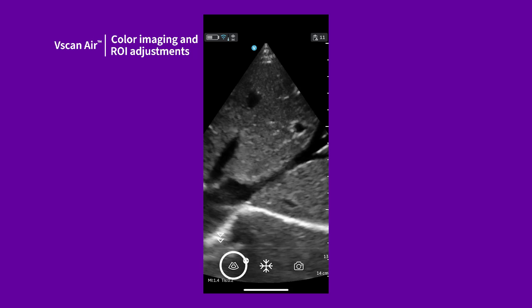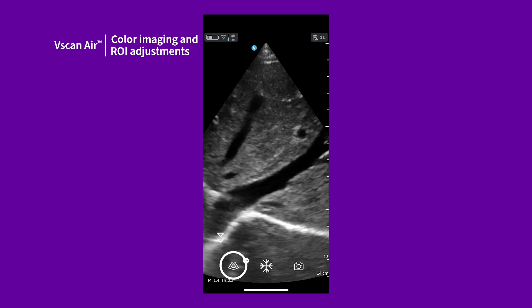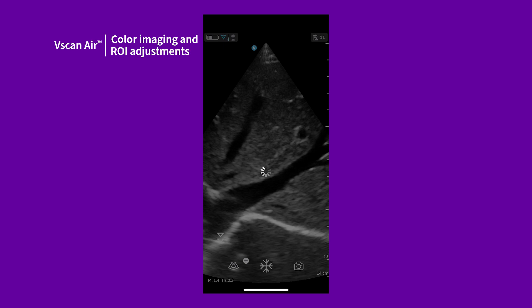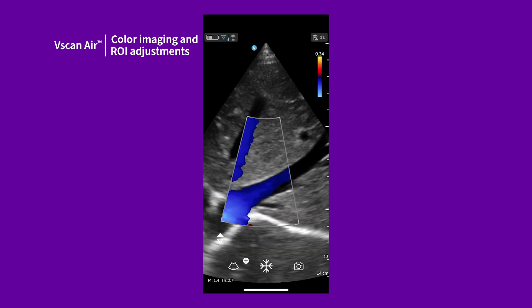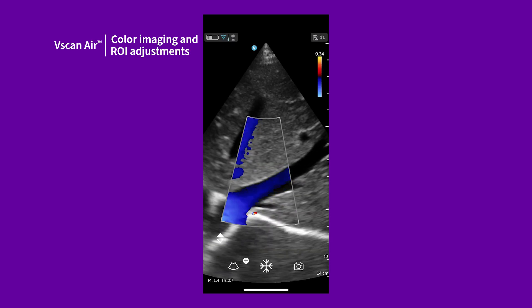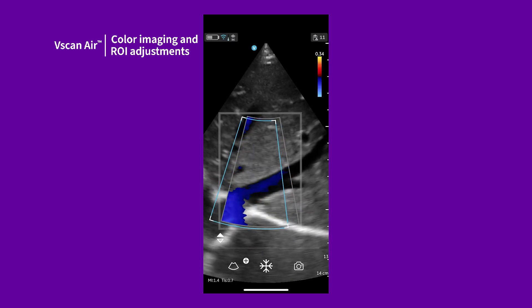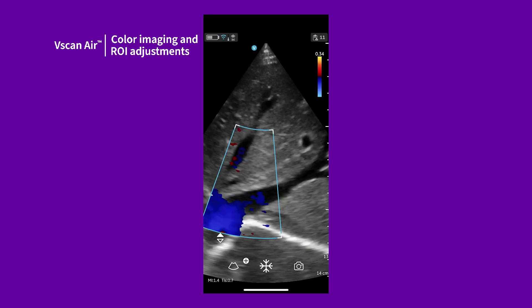Tap the color icon to activate the color region of interest. Color settings have been optimized according to the different presets. The ROI can be repositioned by dragging the box.